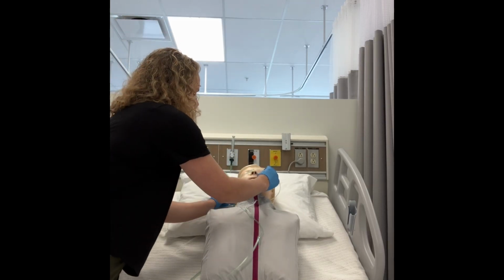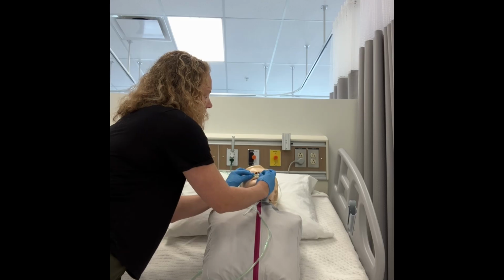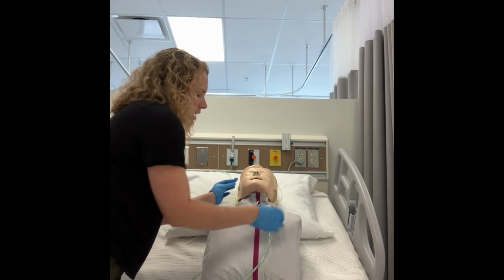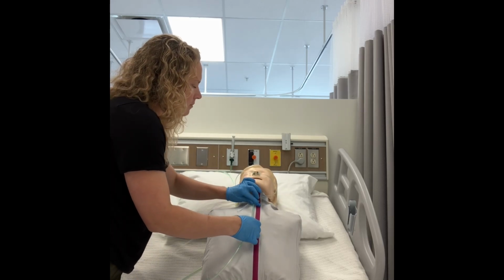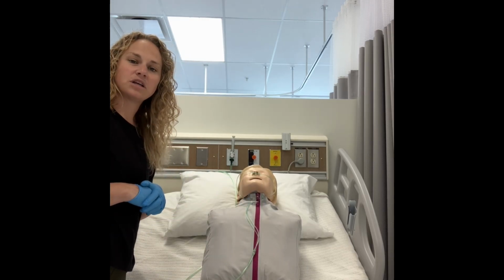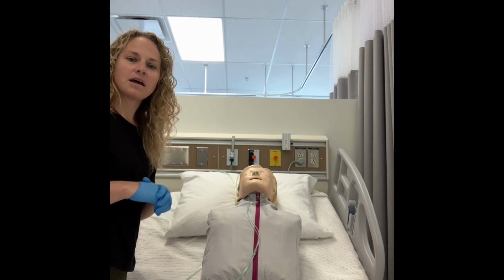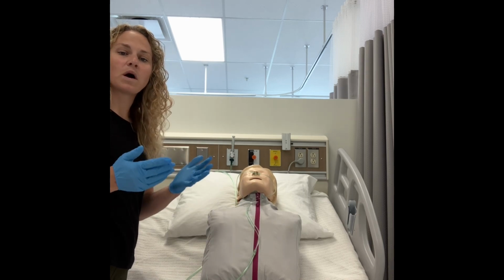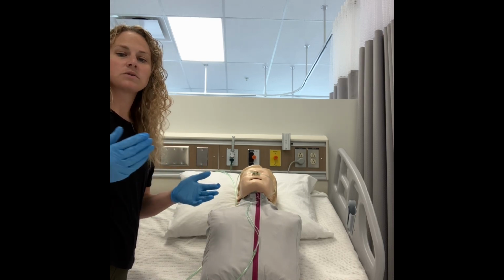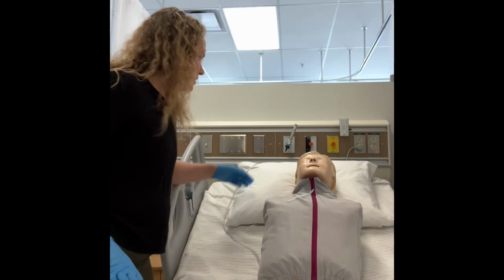So we connect this around the ears, prongs go into the nose, and then we cinch up the bottom around our patient's chin there to hold it tightly in place. A nasal cannula typically has a flow rate of about 1 to 4, although some models will allow you to go higher, up to about 6 liters per minute.